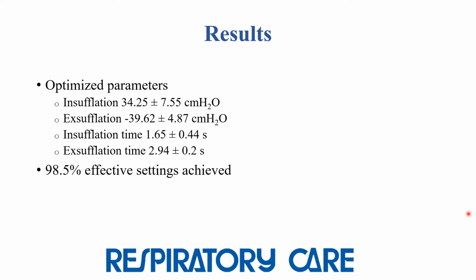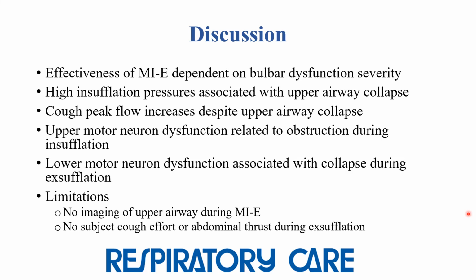After utilizing the waveforms to optimize therapy settings, the mean insufflation pressure was 34 centimeters of water pressure, exsufflation pressure was 39, the insufflation time was 1.65 seconds, and the exsufflation time 2.9 seconds. All subjects except for one were able to achieve optimized therapy settings for MIE after waveform analysis.